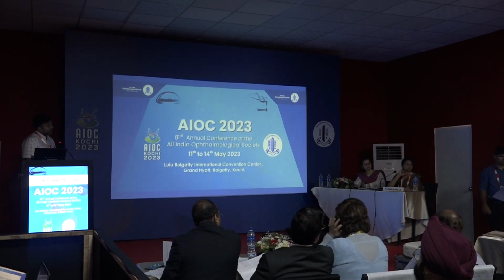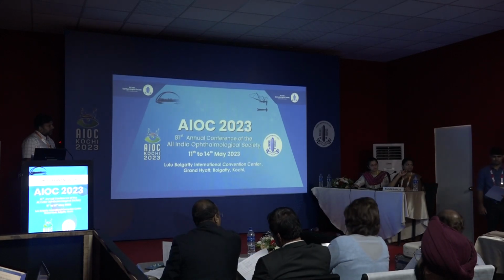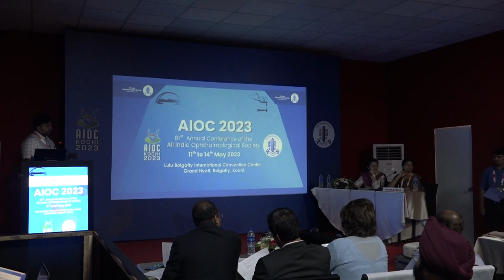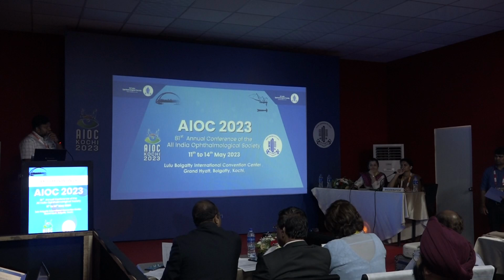In a scleral fixation or when you're fixing the bag, how do you assess how much redundancy is there? Because for the flange to exteriorize, especially when your entry is small, if you have more redundancy, there'll be more exteriorization. You understand? If there's more loose flange inside the eye, more chance it will push out. Unless it really goes and fits into the scleral pocket. You have to plug it. How do you manage that? How do you assess that redundancy intraoperatively? Because postoperatively, you can always see and say, yes, this is more redundant. But intraoperatively, how do you assess behind the iris?